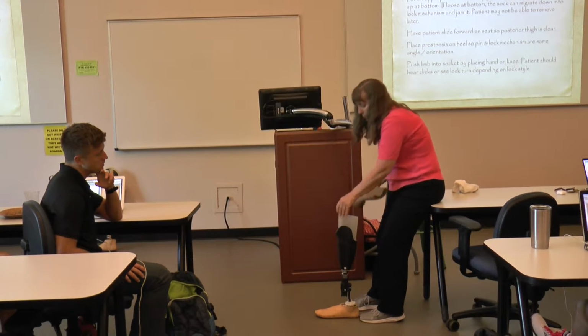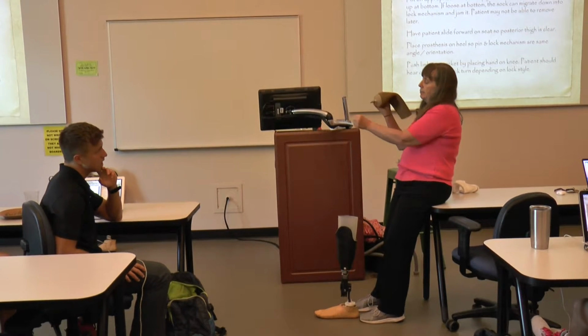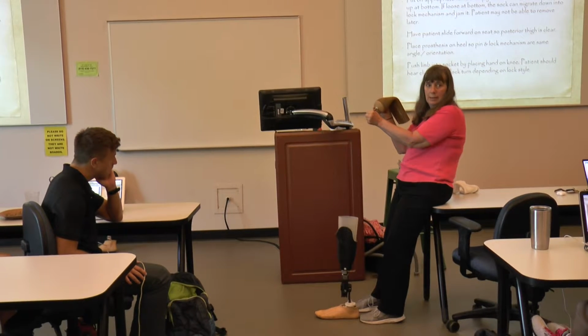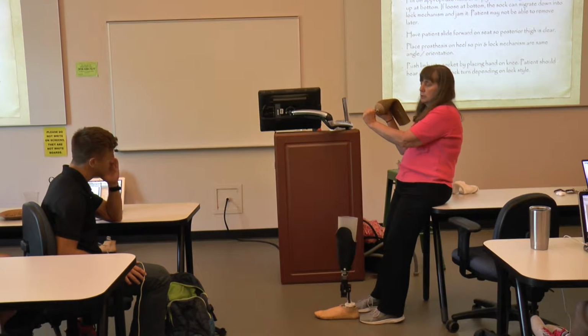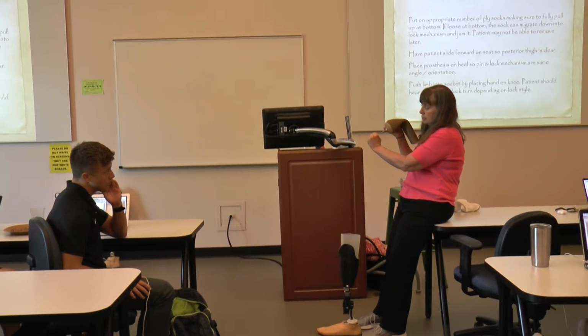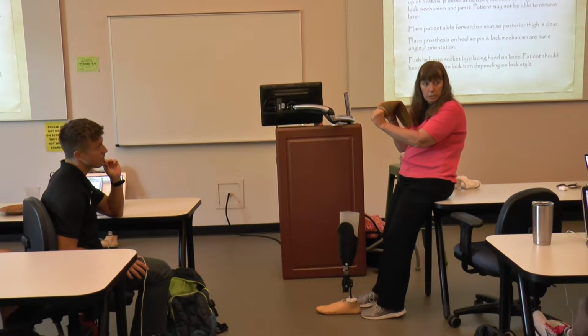The reason is, if the tube is like this and the pin is like this, do you think they're going to slide together easily? If I tilt the tube by putting the foot out like this, and the tube and the pin are at the same angle, you see how they'll slide and catch.